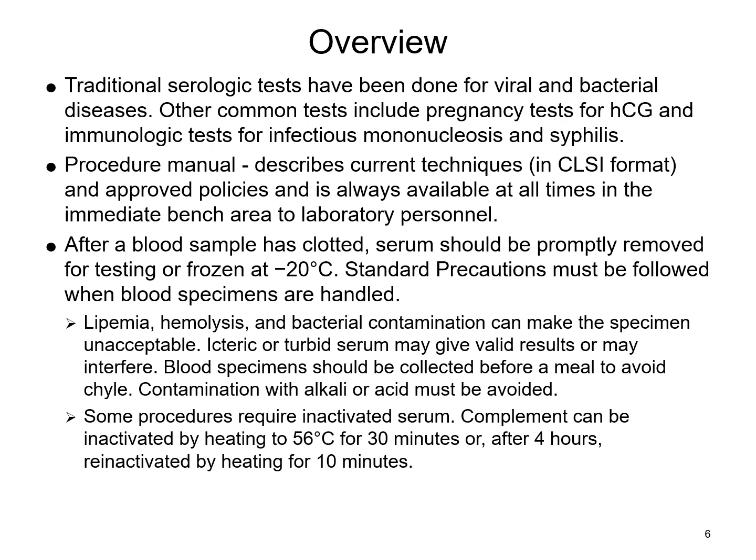One of the very important things included in a procedure is what specimen types are used for that particular procedure. It will list in detail the collection tube, the collection method, and any prep that's required. So you always want to refer to those specimen requirements.